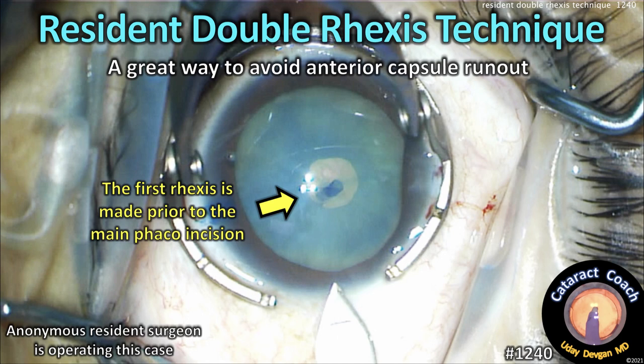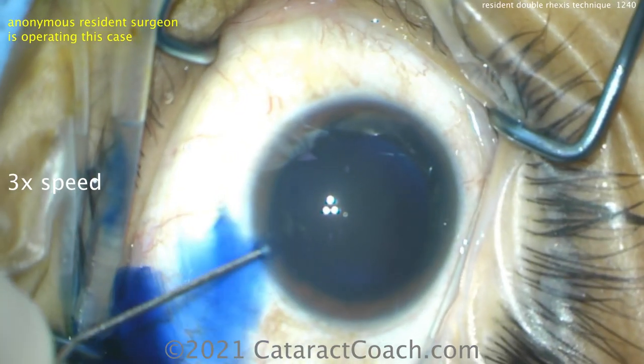CataractCoach.com, resident double rexus technique. It's a great way to avoid the anterior capsule run out. And let's show you the case here.